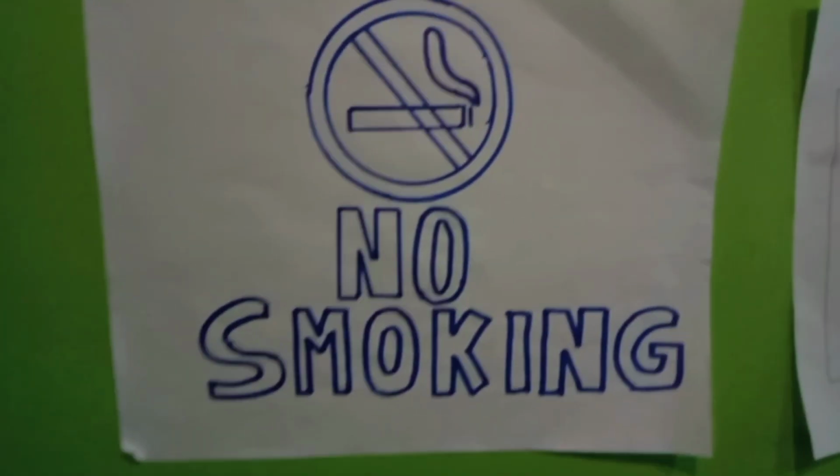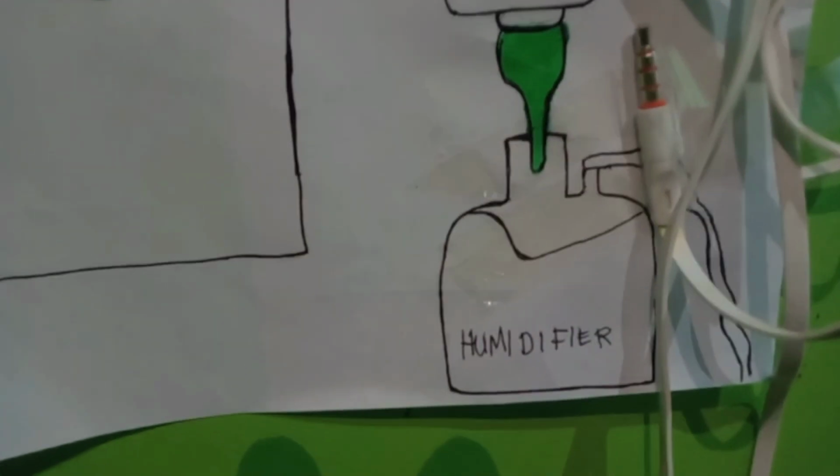Equipment: no smoking sign, oxygen source, flow meter and humidifier, and distilled water.